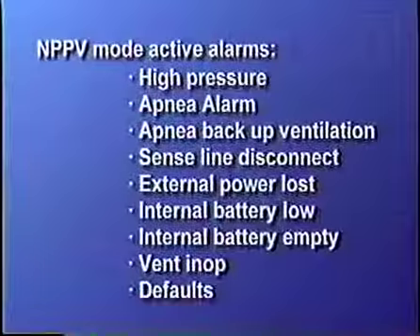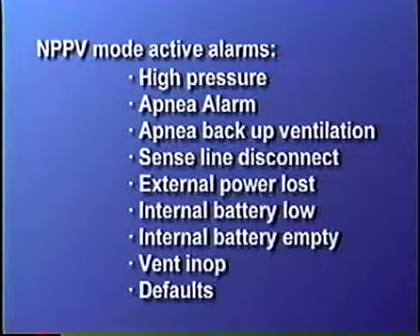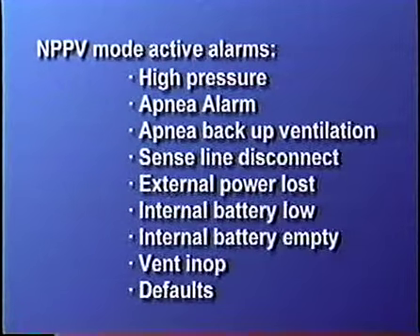The LTV can be used in both invasive and non-invasive applications in a variety of ventilation modes. Non-invasive ventilation can be provided with the LTV in any mode. For non-critical patients, the clinician may choose the NPPV mode to reduce the number of active alarms. In the NPPV mode, only the following alarms are active: high pressure, apnea alarm and apnea backup ventilation, sense line disconnect, external power lost, internal battery low, internal battery empty, vent in-op, and defaults.